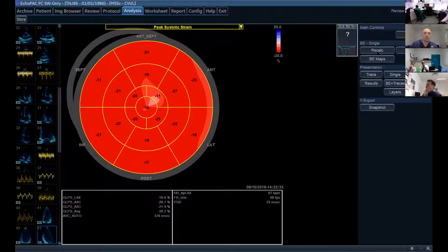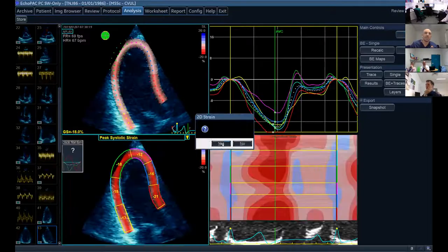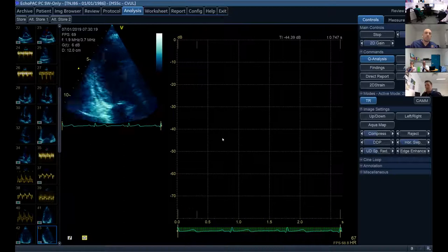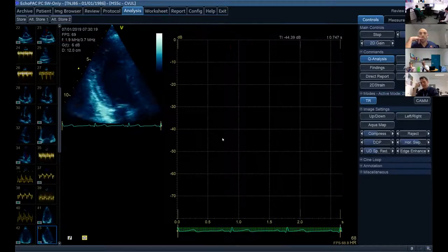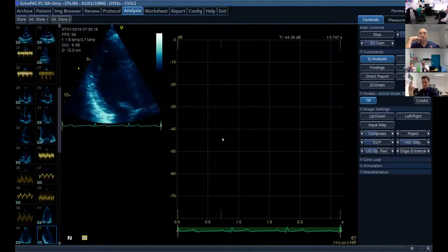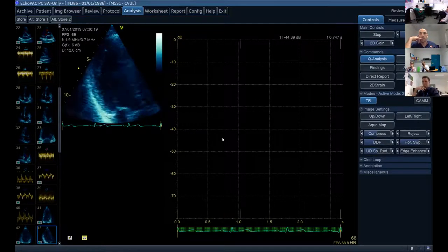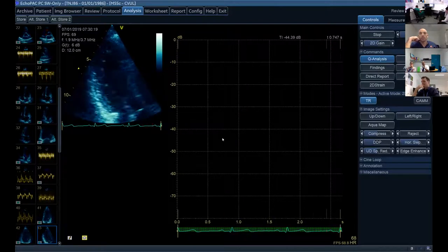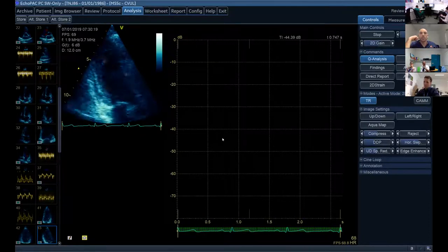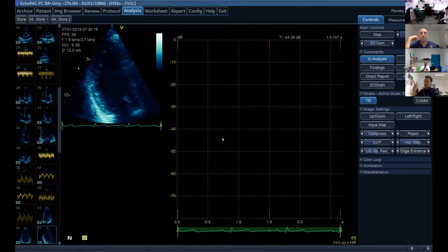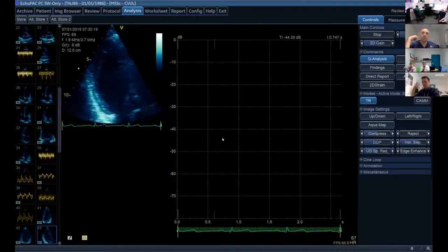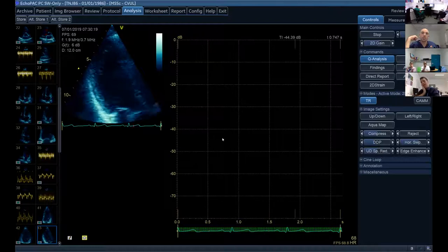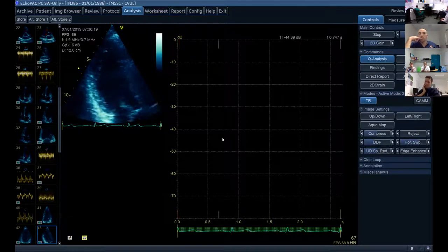With a global longitudinal strain of minus 20% and all segments appearing red, this is a normal study. For the exams, you need to understand how speckle tracking is done, what it is, how you get it, and what other values are expected: strain, strain rate, twist, and torsion. Know the limitations — you need decent image quality, you must optimize your image, ensure tracking is good, and ideally repeat values three times to confirm consistency.